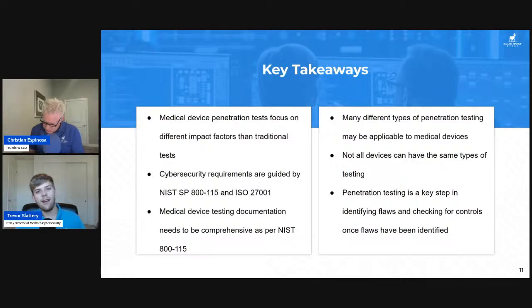That's when we're looking at that test plan, the test cases, and the report, and making sure we're hitting the right level of detail in all those and the expected information.